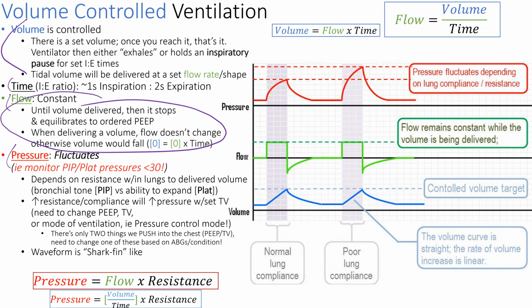Usually you breathe about 20 breaths per minute, right? So you're just 1 second in, 2 seconds out, all right? That's 3 seconds. If that 3 seconds is your inspire, expire effort, that's 20 times per minute, right? 3 times 20 is a minute, right? So you can change that though. We can make it 1 to 3. We can make it so they exhale longer, right? Of course, that's going to reduce your respiratory rate. So we can change those things to affect our respiratory hemodynamics.